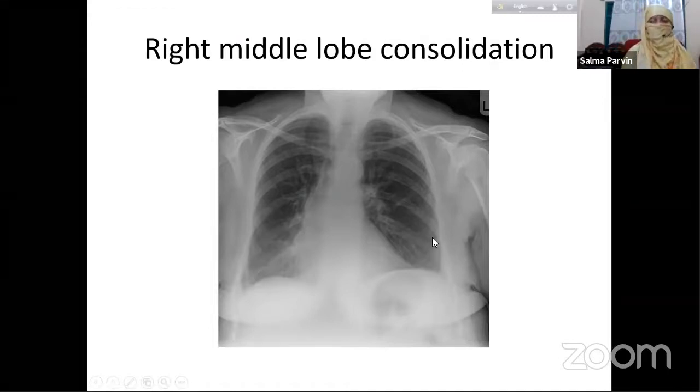But you see, this is a female patient, she is having superimposed soft tissue opacities along the bases of the lungs. And again, the lungs on both sides are not that symmetrical, and on the left side, despite the opacity, you see the vascular markings running in the lower lung fields well. But what about the right lung field? There are no vascular markings to be seen here. So the soft tissue shadows producing a common haze on both sides are present.